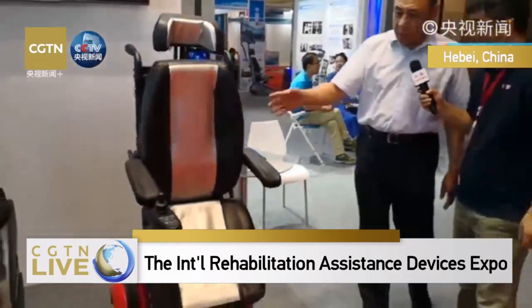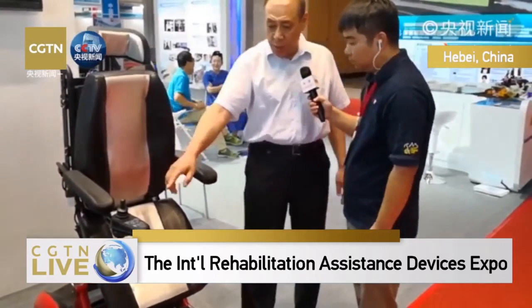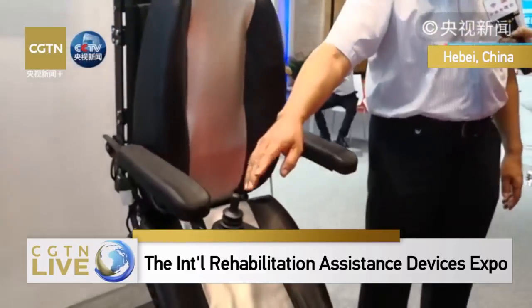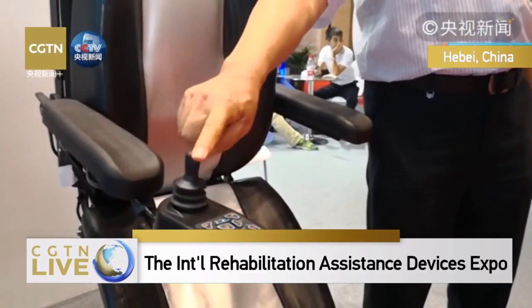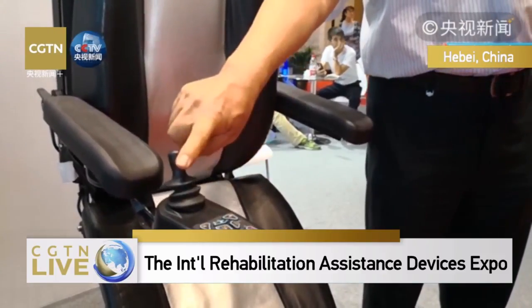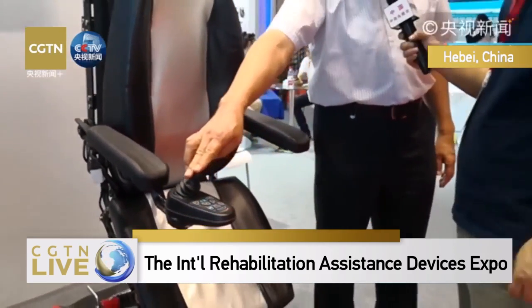For example, these are mobility assistant wheelchairs. It has 3 postures. If you press this button, it can help you to walk, to stand and lie down. So it has 3 postures. This is a standing posture.